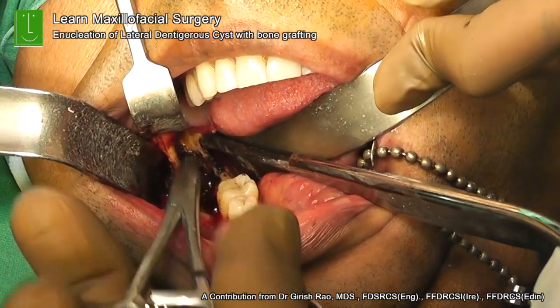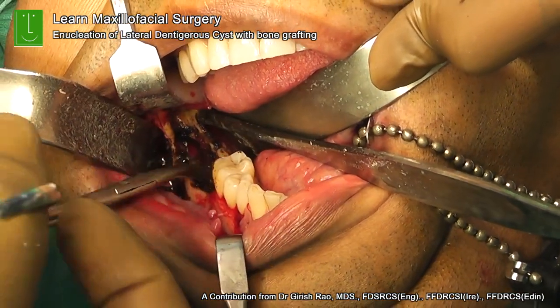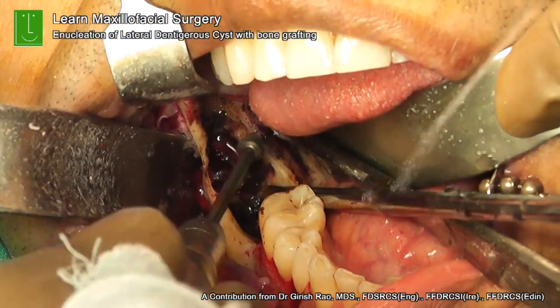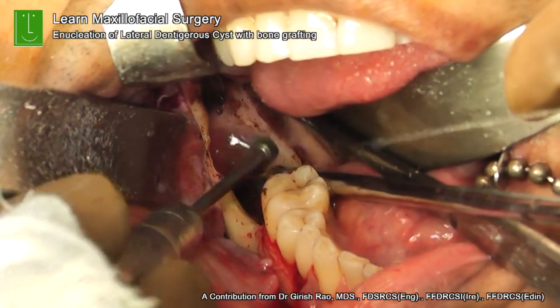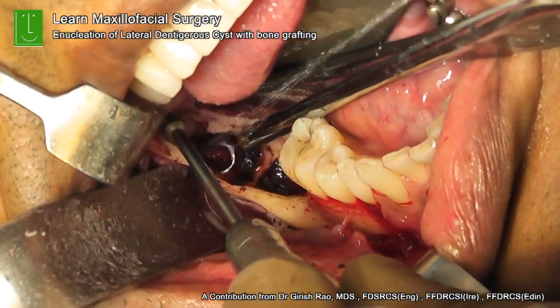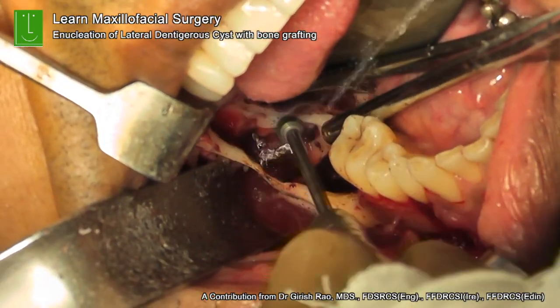So the way in which you use Carnoy's solution is you use a peanut. This is a small gauze which you pick up in an artery forceps, a curved artery forceps, and essentially coat the entire cyst lining, or cyst wall basically. And once that has been done, you need to take out any of the debris which is there. So again, curettage. And I like to use a simple pass with a drill.